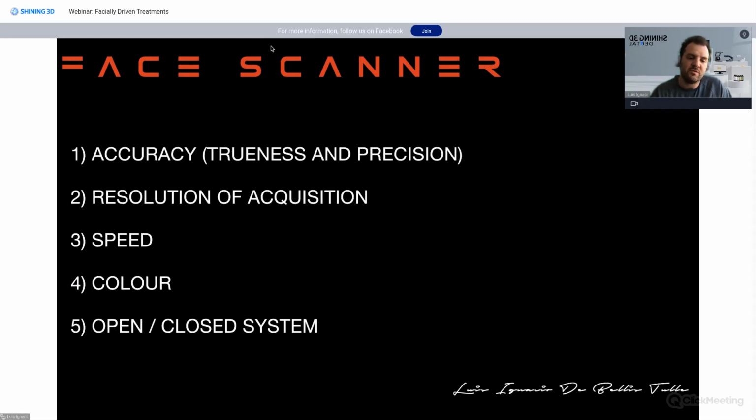You can open it in Photoshop or whatever you use to post-process your pictures, change the contrast and brightness, do whatever you want, and then export it with the same name that the file originally had. And when you load that into a CAD software, like ExoCAD, Blender, or MeshMixer, you will get a nice picture in 3D.